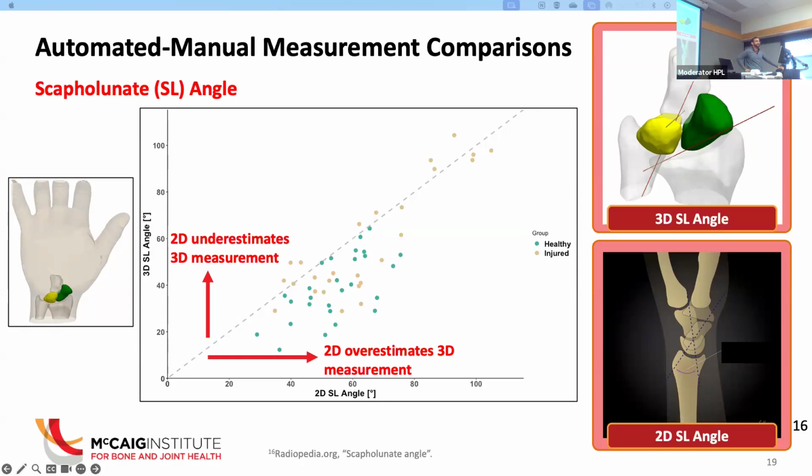Can I piggyback off that? With your contact biomechanics, it's based on the radius, but I'm wondering if the actual area of contact is moving around on the scaphoid and the lunate. Have you looked at that? That's going to be part of my kinematics work, looking at how that centroid is shifting on the scaphoid, because that will help us appreciate whether it's in the flexion extension direction, pronation, supination, or radial deviation, ulnar deviation. That will help us understand more about how the bone is rotating when you apply load and through different positions. I wonder if that ties in. I think it would, for sure.